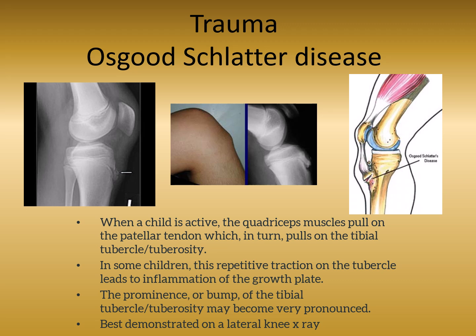Let's look at Osgood-Schlatter disease. In that lateral tib fib position, we were looking at the tibial tuberosity in profile. This is a lateral knee position. The lateral knee position is the best position to demonstrate Osgood-Schlatter disease. This happens when the patellar tendon inserts at the tibial tuberosity, goes across the patella and inserts into the quadriceps. This tendon takes a lot of stress, especially for people that are very athletic and do a lot of running and jumping, basketball, football and soccer.